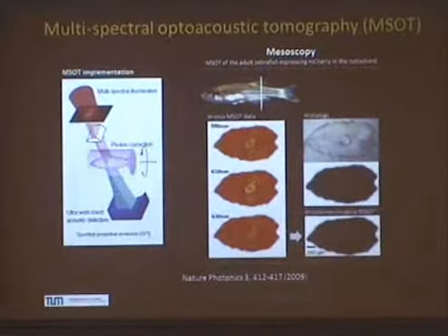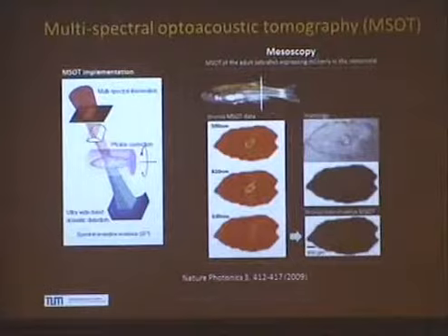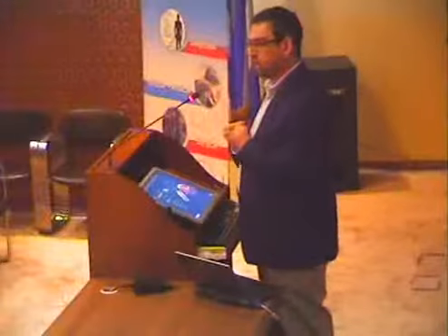And this just shows, it was published a couple of years ago, that we can do very high resolution imaging, so we can go down to 30 microns, 20 microns, and so on with this technique. So I think by combining optoacoustics and fluorescence, we're solving the fundamental problems of optical imaging, because we're imparting specificity, sensitivity, but also the ability to visualize beyond the surface.